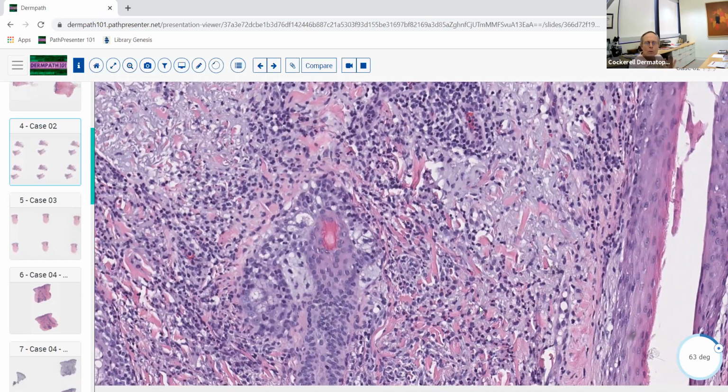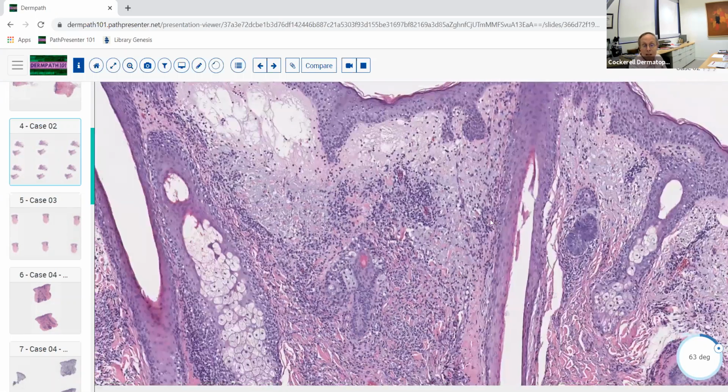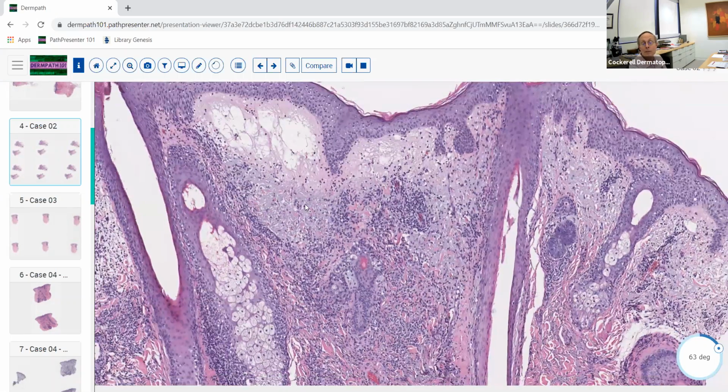And then you get what's called phlegmonous inflammation in the dermis, where you get a diffuse interstitial, mostly infiltrate of neutrophils over a relatively broad front. And that's distinct from some of the other neutrophilic dermatoses, where you get more of a nodular infiltrate of neutrophils, like in Sweet's disease, for example, where you get a dense nodular infiltrate of neutrophils with papillodermal edema. This papillodermal edema is really secondary to the fact that the entire dermis is edematous, not just the papillary dermis, but also the reticular dermis. And it's got this more diffuse infiltrate of neutrophils.